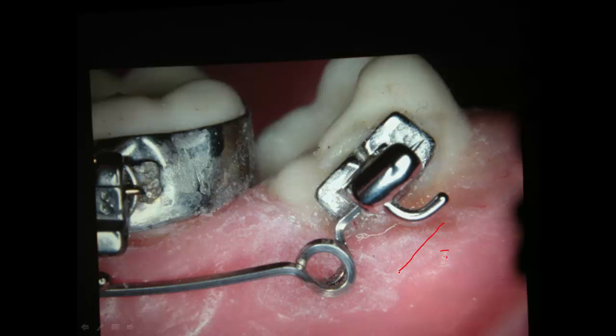You come down with the arch wire, make a 90-degree bend, and then you circle around, and then you come off of this. Normally you'd go in this direction, but you'd have a pretty hard time inserting because this leg will be sticking in the tissue down here. So maybe you set it like that. So now I can take this part of the wire and insert it in here, and then raise up, mark where you're going to put the little hook in it, and then you take it back out again, make the hook and everything, slip it back in, and then bring it over here and activate it, bring it up and hook the hook where you want it, same way as you did the other one.